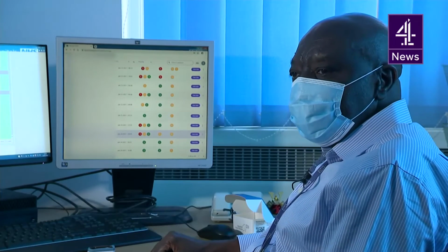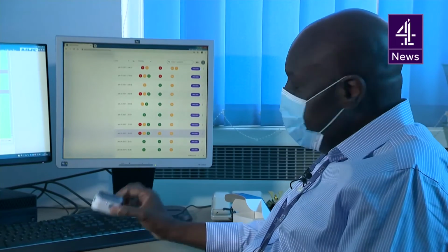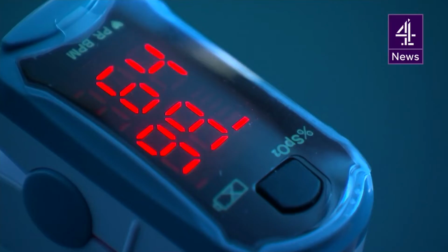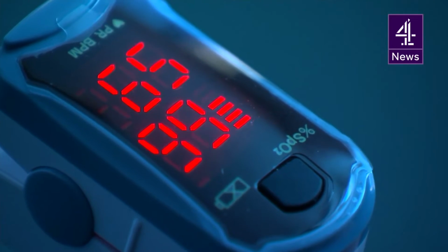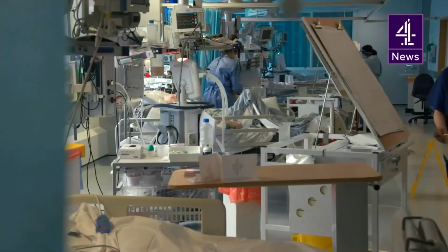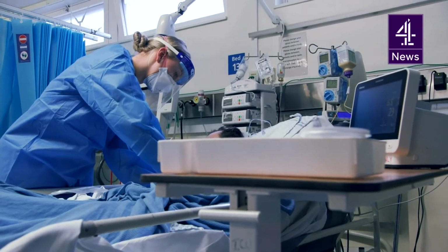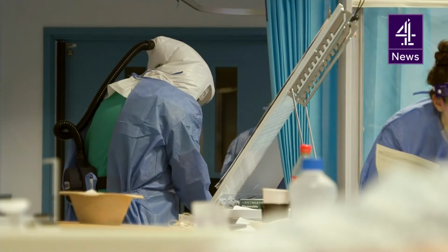And how do they measure their oxygen and their... They measure the oxygen using this little gadget called an oxygen meter or oximeter, which they pop on their finger, and it'll give them a number, usually in the high 90s for you and I. But when they're unwell, it could be the low 90s or even 80s, in which case they need to be back in hospital. So far, though, only 45 patients have had to be readmitted. And sadly, there have been 15 deaths, but they were all in hospital.